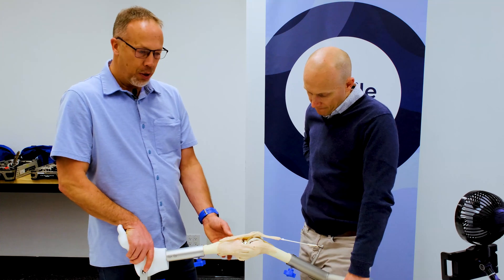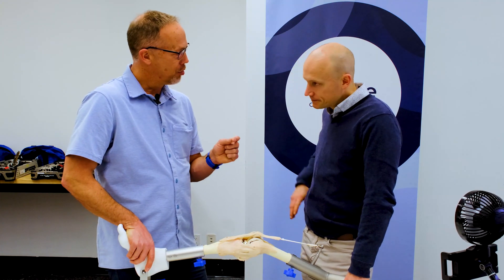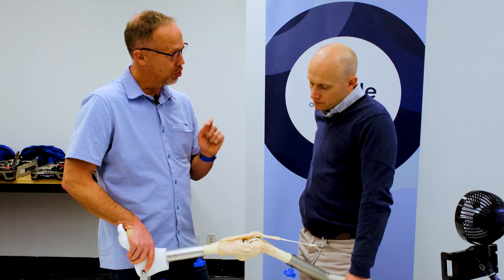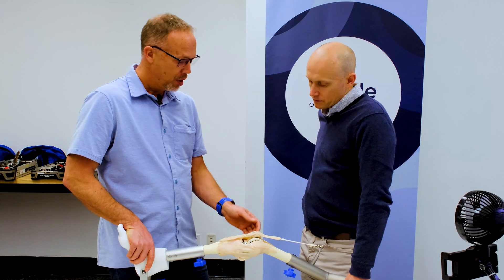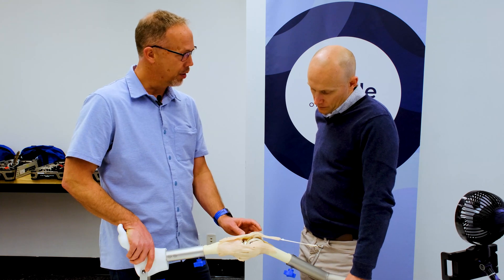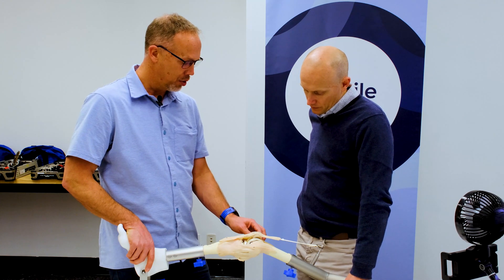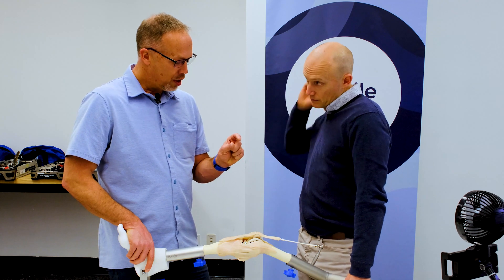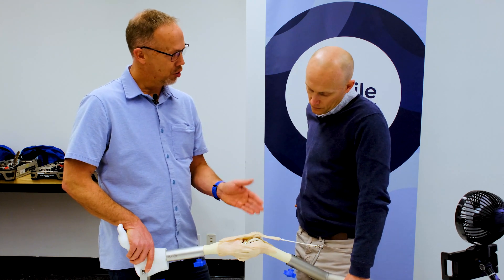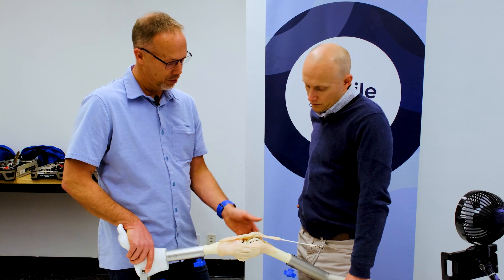In total knee replacement, patellar tracking problems are probably the most common complication we see — not the most serious, but the most common. There are lots of technical issues that affect patellar tracking. Marginal errors in a few of them can cause this, or big errors in one issue can cause it.